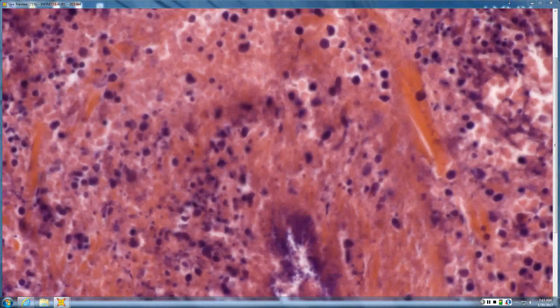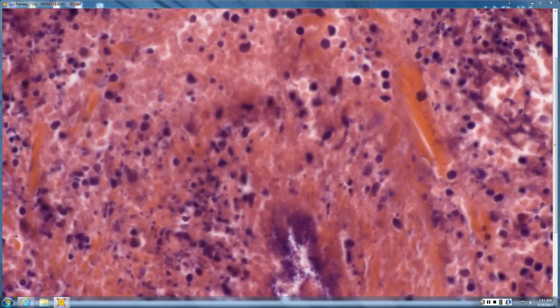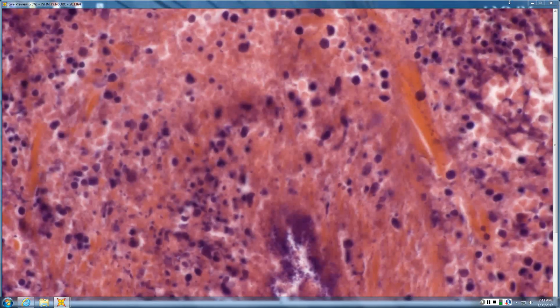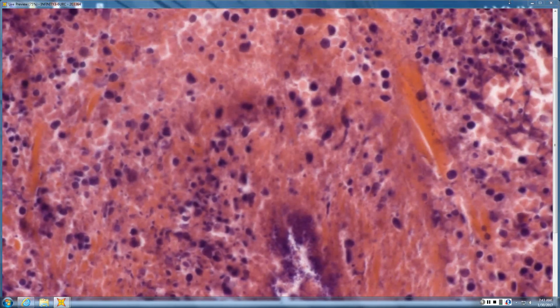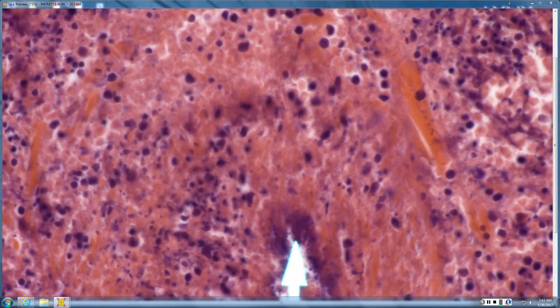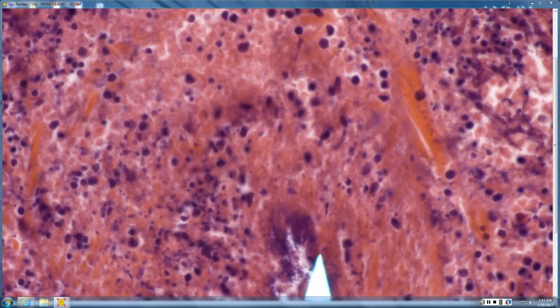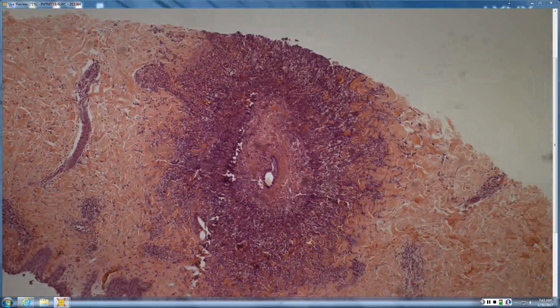Yeah, so there are some infectious things, non-infectious things like folliculitis decalvans, pustular drug eruption. AGEP can be a superficial pustular folliculitis. This is pretty deep, and so you think of often infectious things. What are these little gray round things in clusters? Those like staph grains? Like staph. So this would be a deep suppurative folliculitis with staph would be... Botryomycosis? Yeah, or just a furuncle.